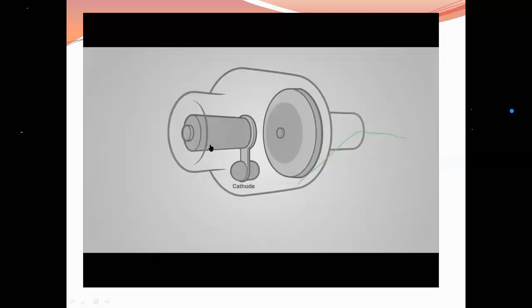In this case, the cathode is basically the X-ray filament, generating those electrons, and this is the tungsten target, which is also called the anode. So all the electrons are striking this target over here. Once they hit this anode, this will result in the production of X-rays, which you will see in a moment in the form of purple arrows.